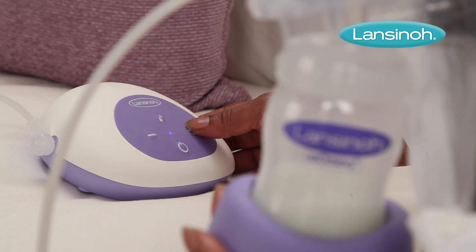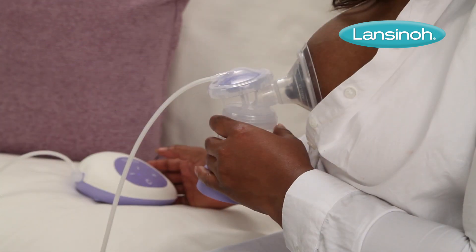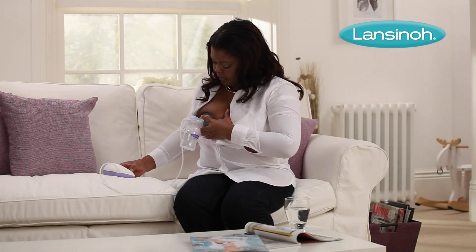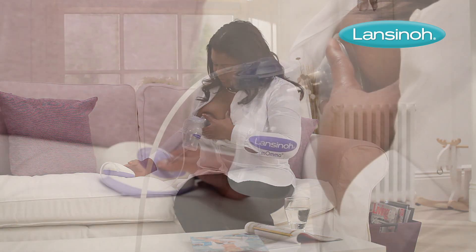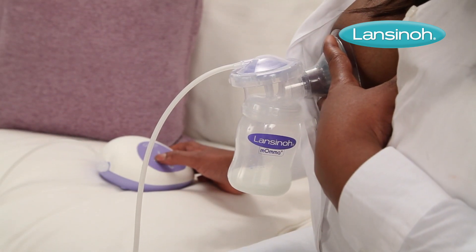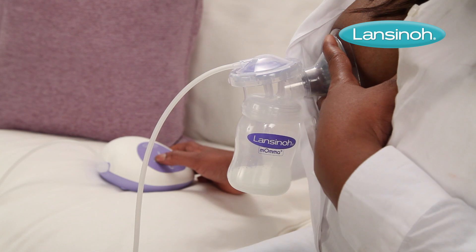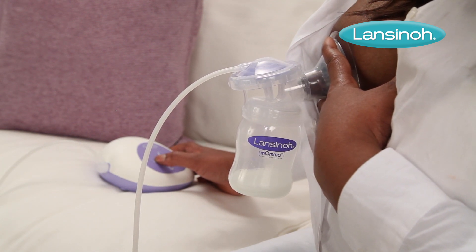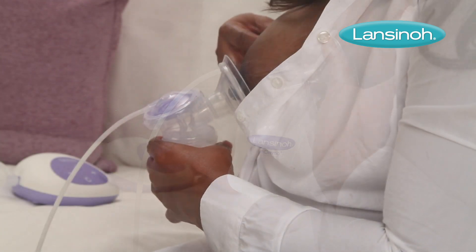Offering a choice of six adjustable suction levels, the pump enables you to tailor both the let-down and expression phase for a more comfortable and relaxed pumping experience. Your preferred suction level is easy to set, thanks to the LED indicator which displays your suction setting at all times.